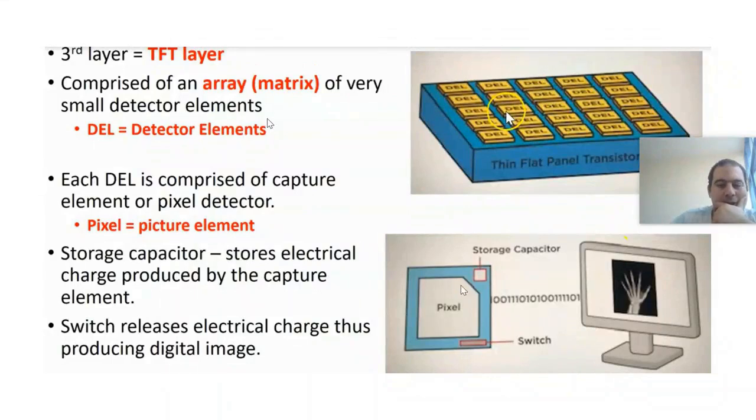I have now taken my data from this pixel area and the electronic signal has reached the pixel. So where do I send this electronic signal? I should send it to my system for processing, correct? But shouldn't there be a place to store this electronic signal so it doesn't get lost?